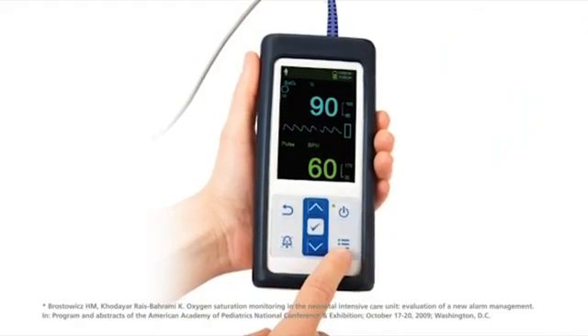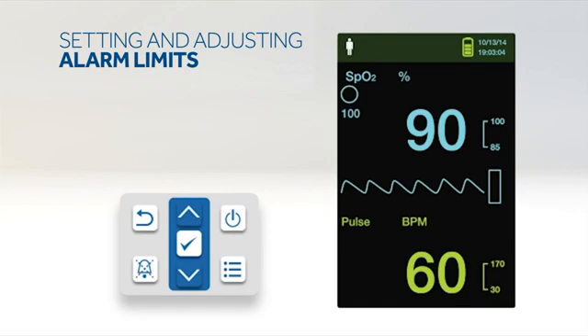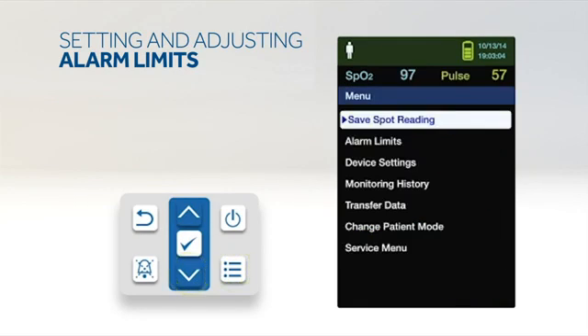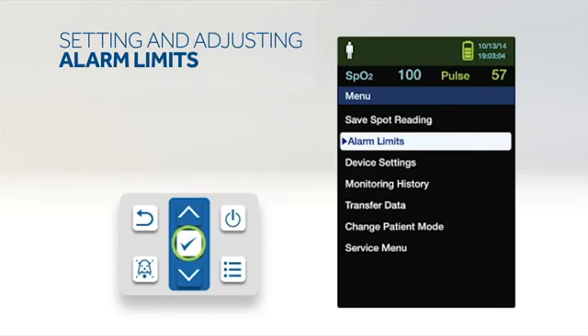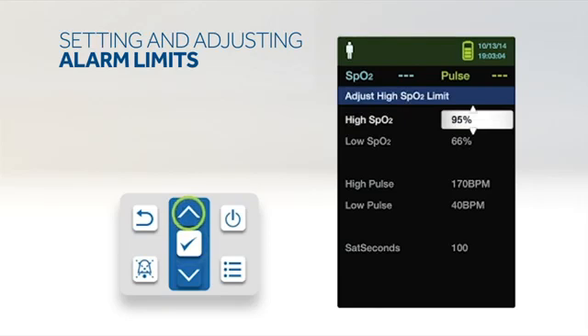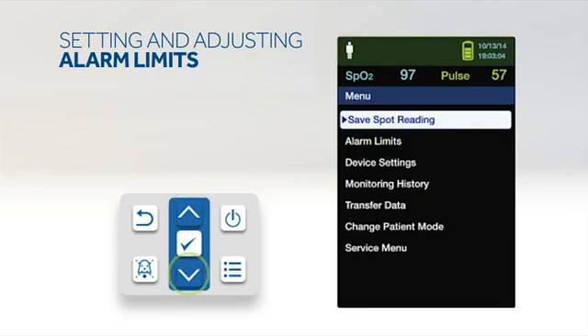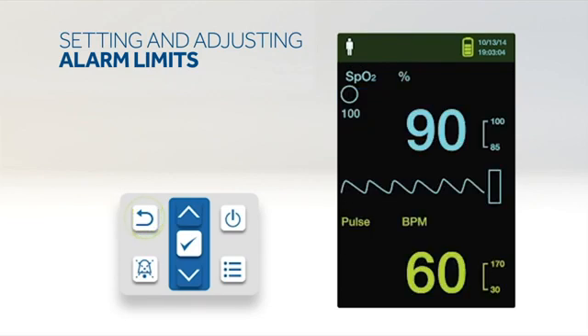The PM10N incorporates Nellcor SatSeconds, an alarm management system that analyzes SpO2 events to avoid triggering alarms unnecessarily, reducing nuisance alarms. To set alarm limits, press the menu button, press the down button to highlight the alarm limits menu item, and press OK. Alarm settings include pulse rate and SpO2 alarm limit ranges and the Nellcor SatSeconds option. Press the up or down button to highlight the desired option, press OK to select, press up or down to change the value, and press OK to save.